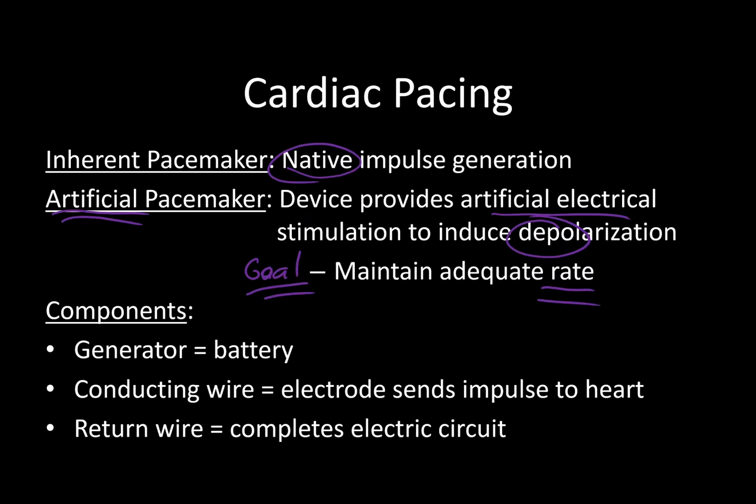It's the idea that once it's been established that the patient has a bradycardia, and that's the big one, or a conduction disorder that warrants permanent pacemaking, the cardiologist will then determine what the most appropriate pacing device and mode is for that patient. It really is just up to the MD, and it has to be tailored with every case.